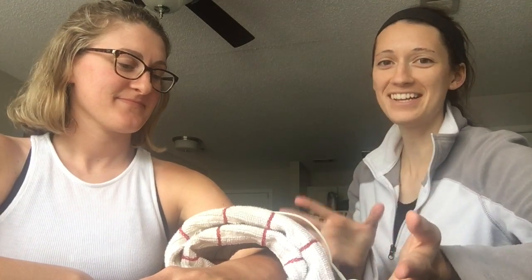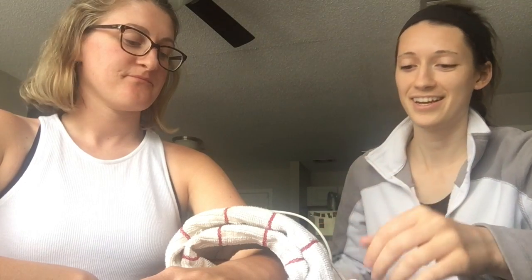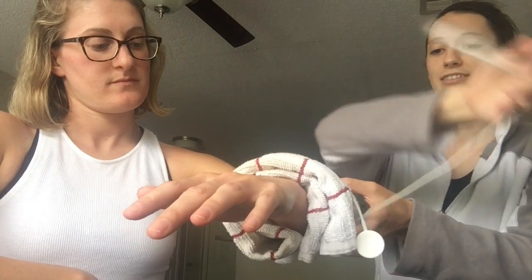So this is the treatment, and we made all the settings that I previously said, and then you would leave this for 30 minutes. You can leave it for 30 to 60, but this is her first treatment session, so we're just going to do 30 minutes, and I would come by every 5 minutes and make sure that everything's good. Any problems? No. Okay, and then at the end of the treatment, we will take it off and assess the skin, and it looks good. Have any problems? No. All right.